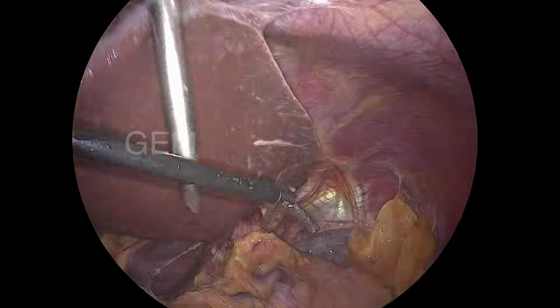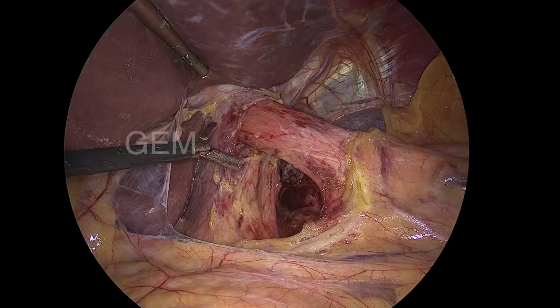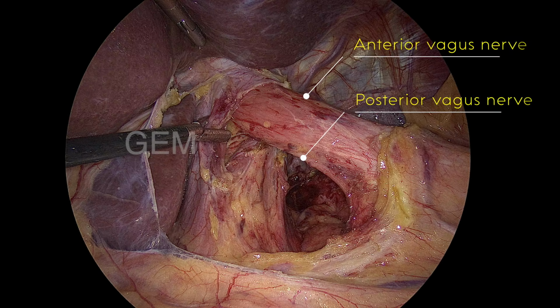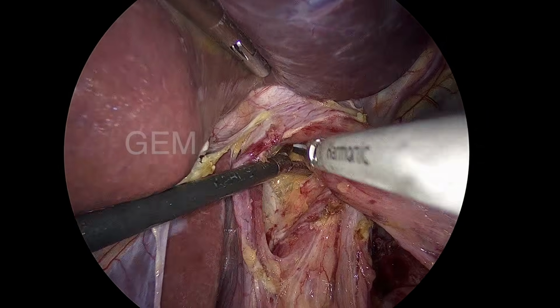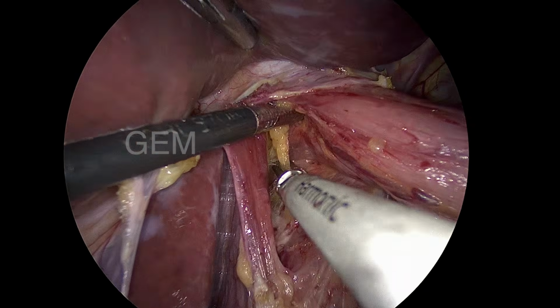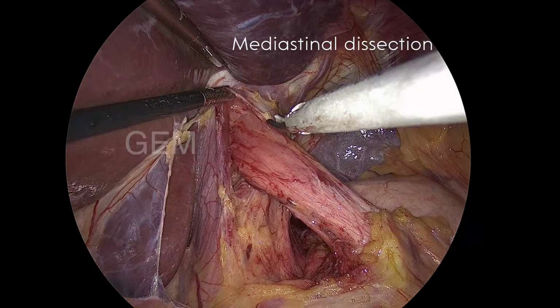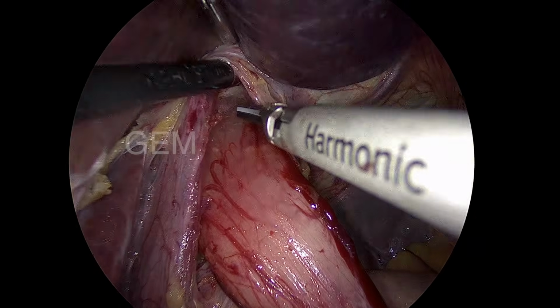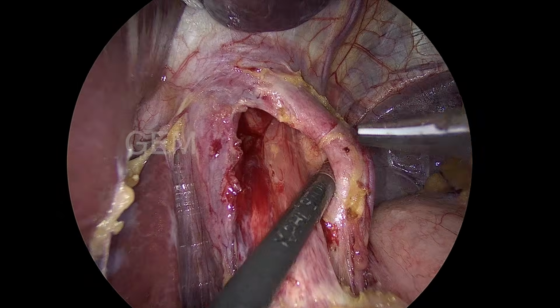So, I am making another port, a subxiphoid port, so that retraction of the liver is better. So, I can do the transhiatal, transmediastinal dissection, and most of the time, the esophagus will be dilated and a little bit tortuous, commonly on the right side. So, that is why we dissect the right side first to straighten the esophagus, that will relieve the symptoms. So, always the myotomy is to be done by straightening the esophagus first, and then mobilize the esophagus on the anterior and right side and left side, and very minimal posterior dissection is enough. If it is curved, if there is a sigmoid, then you can do posterior dissection.